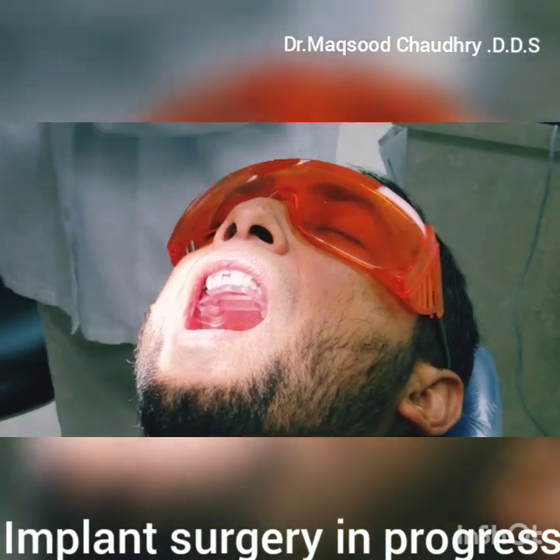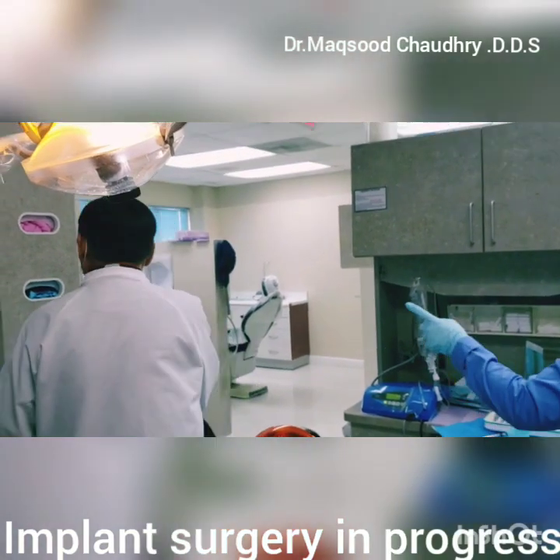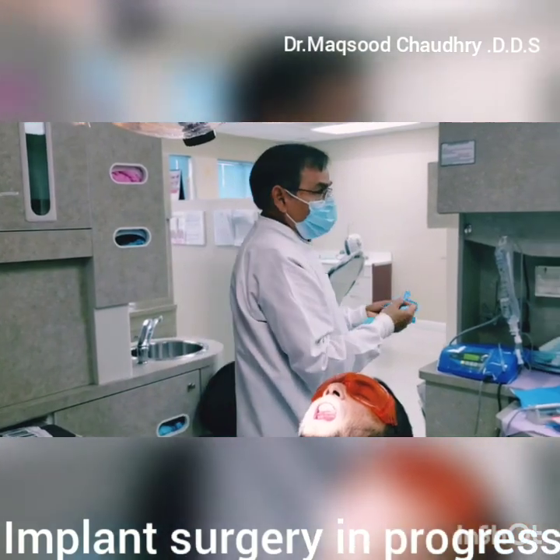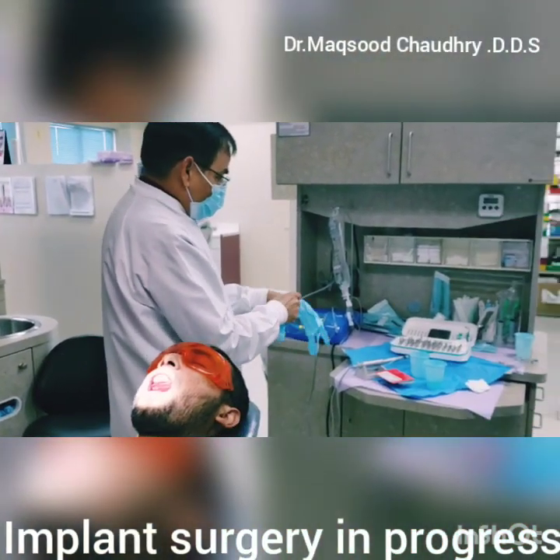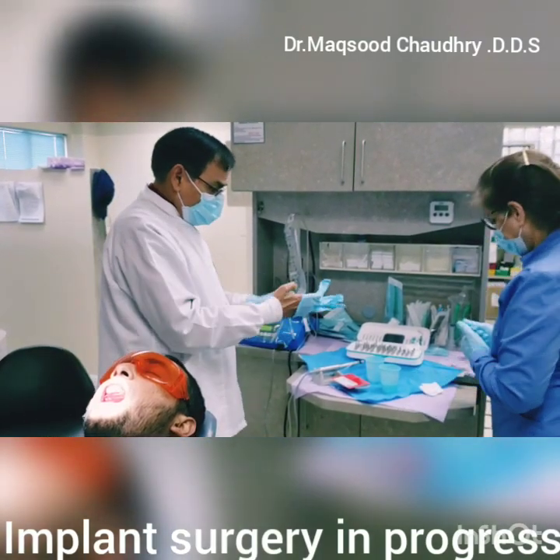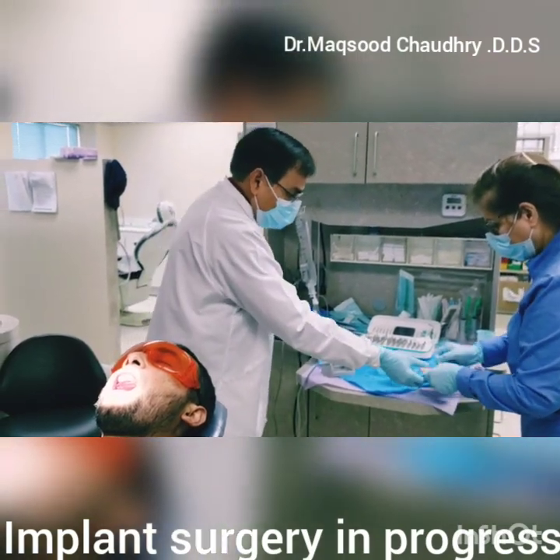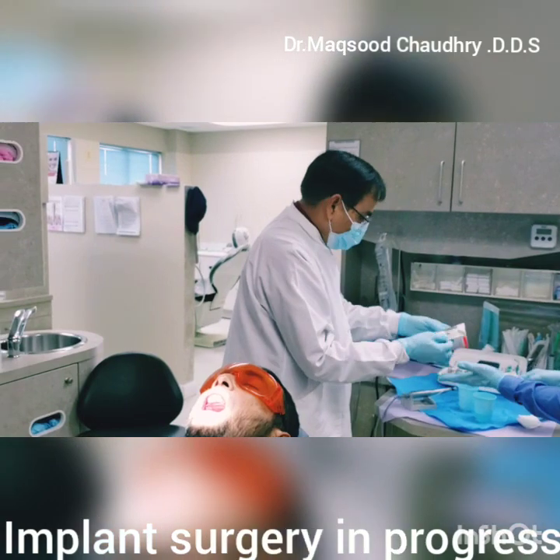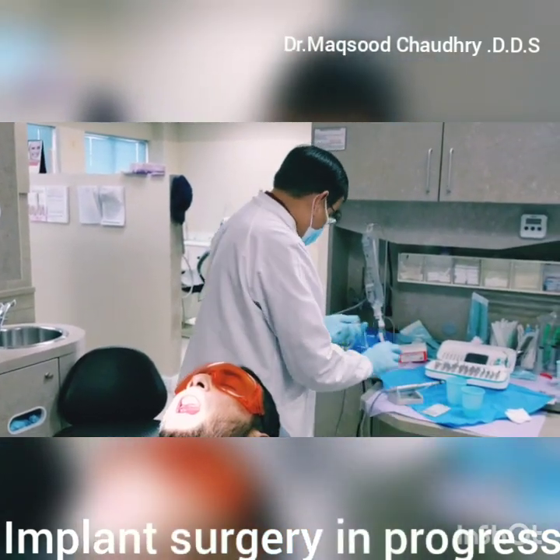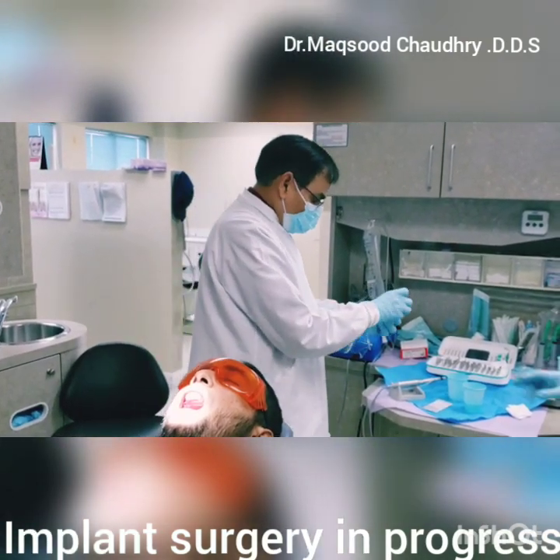This is our implant. Make sure we have the appropriate size of the implant. We are just setting our motor for the insertion of the implant.